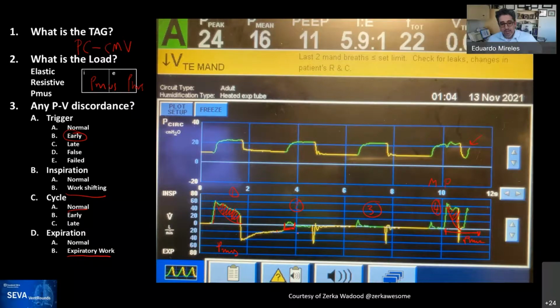So from this point to this point, the tidal volume is unaccounted for because the patient essentially exhaled. And so when the patient exhales, the exhaled tidal volume gets added to this, if I'm correct, Rob. The exhaled tidal volume would be the area under the yellow curve. Yes.